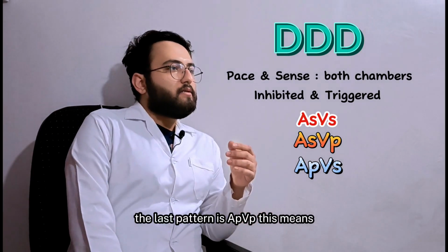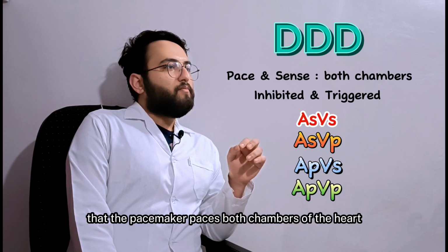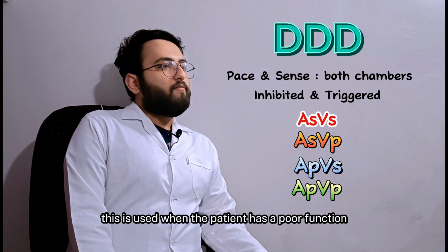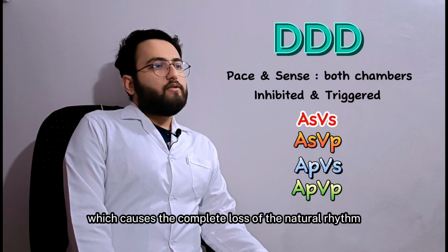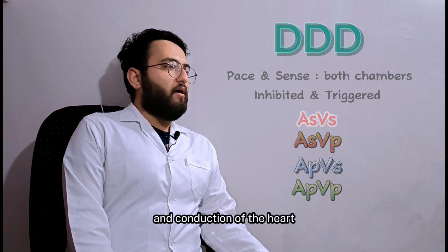The last pattern is APVP. This means that the pacemaker paces both chambers of the heart. This is used when the patient has a poor function of both the sinus node and the AV node, which causes a complete loss of the natural rhythm and conduction of the heart.